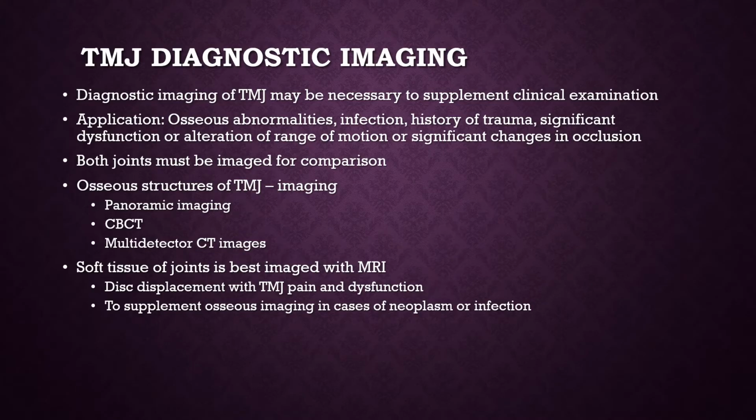For performing diagnostic imaging of the TMJ, it may be necessary to supplement it with clinical examination. It's important to understand that specifically for TMJ disorders, a thorough clinical examination and arriving at a diagnosis is of utmost importance before diagnostic procedures are advised.